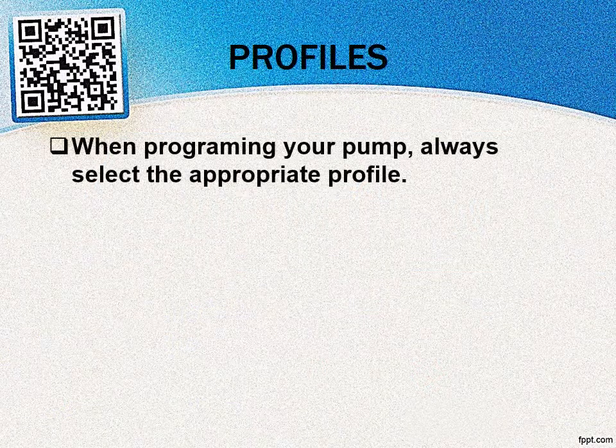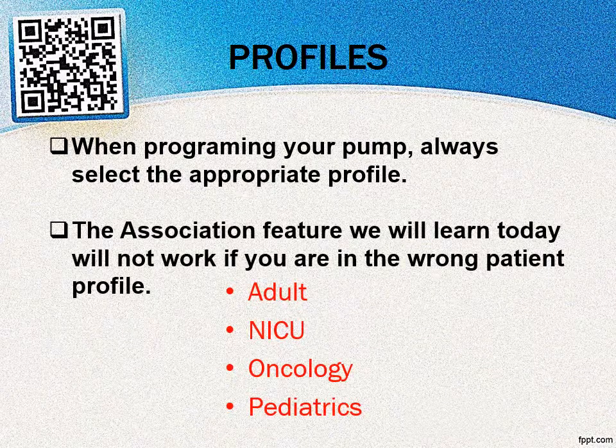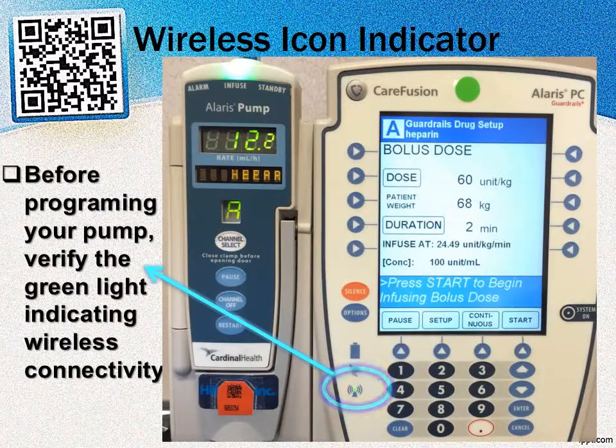One thing to be aware of is when programming your pump, always select the appropriate profile. The association feature we're going to talk about today will not work if you're in the wrong patient profile. Before programming your pump, verify the green light indicating wireless connectivity.